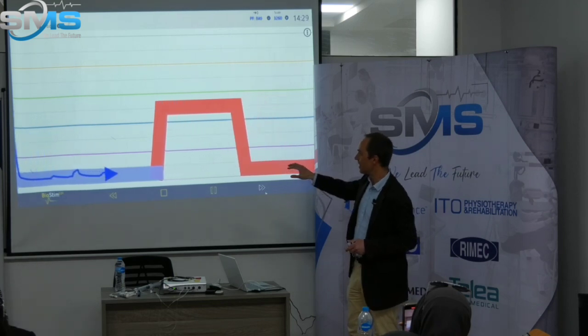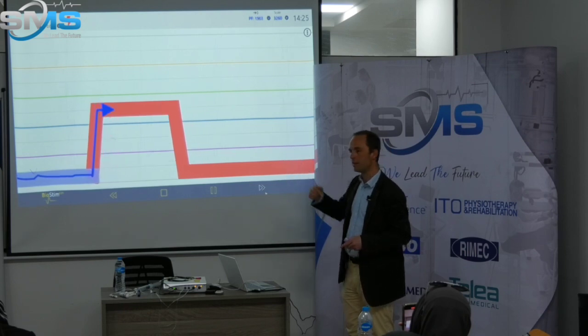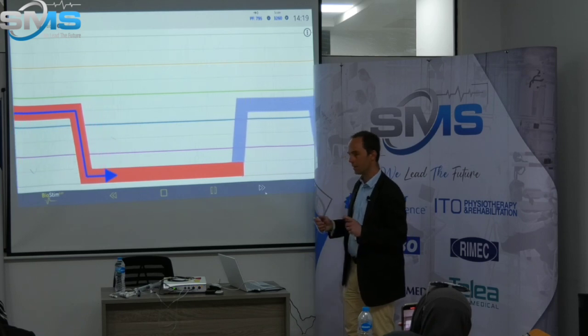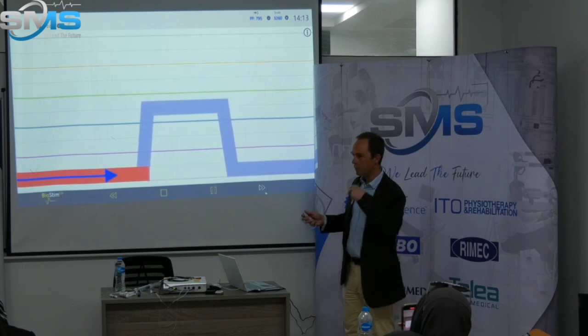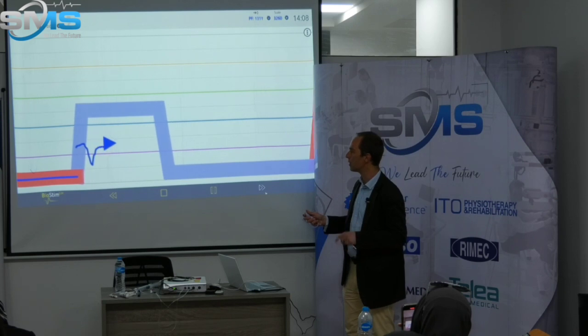Nearly nothing, let's say. So again, we'll do a stimulation. Here, she can feel the muscle. So maybe closing your eyes, you can feel it a little better. Okay, now my turn to play. And time by time, we feel which muscle we have to contract. And here, we'll see, okay, it's a little better.